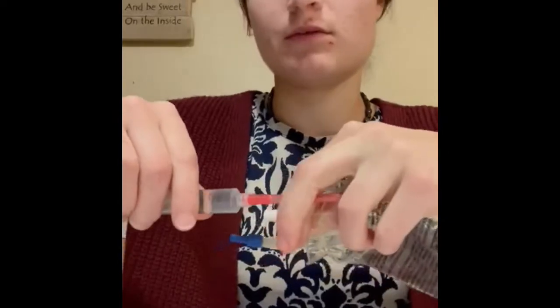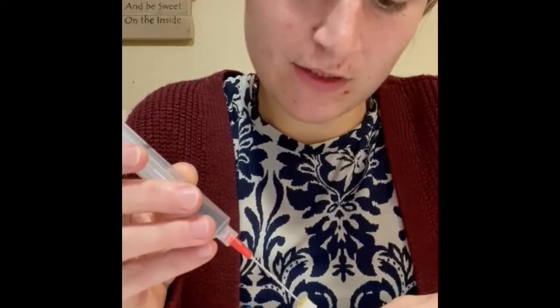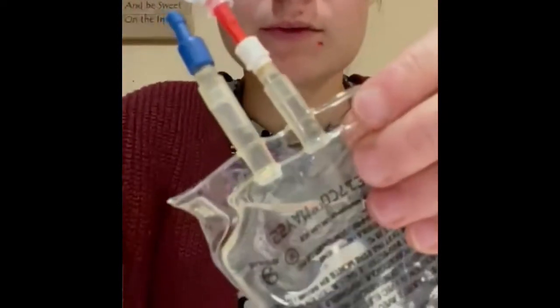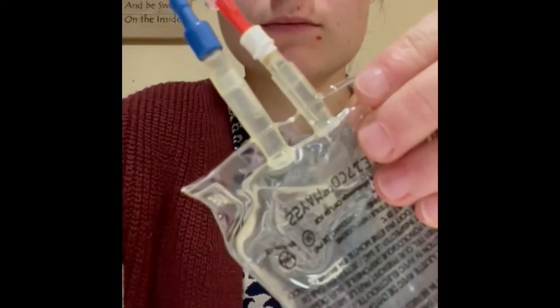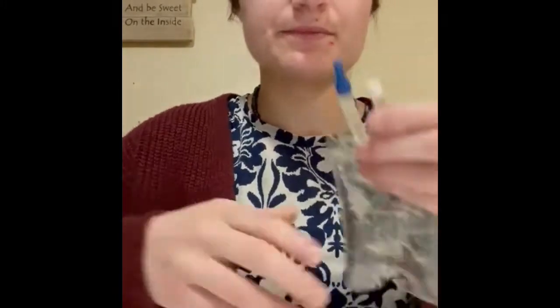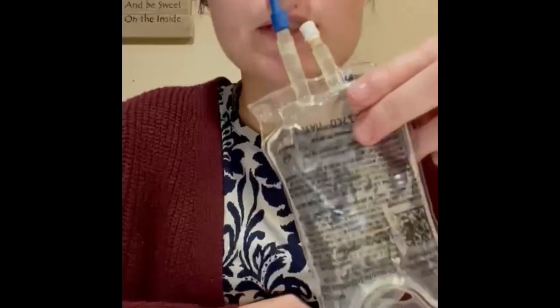So we use this port here. So I'm going to take this off, stabilize it here, right in the middle. Go in, inject. And I'll do that with all 12 of them. So I'm going to scoop motion and get this back on. And that goes in the sharps. So I've done all 12 of them into here.